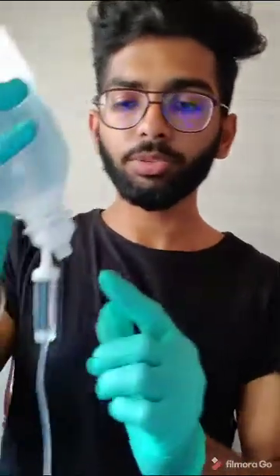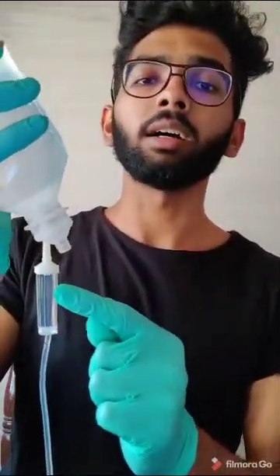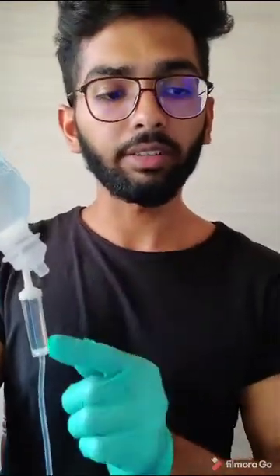We will open the regulator by pushing it on the bigger side of the regulator. As you open it, you can see here, let me show you what you will be seeing here. You will be able to see the drops going in the chamber of the IV set.